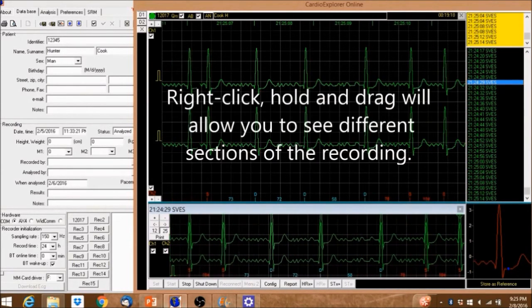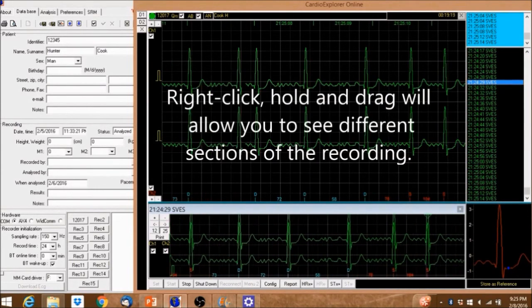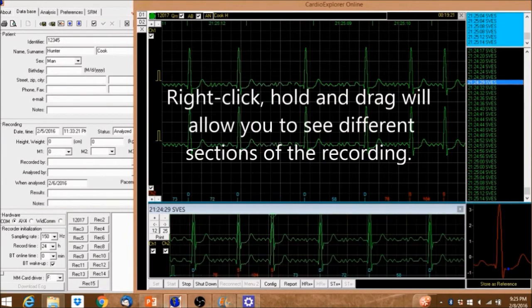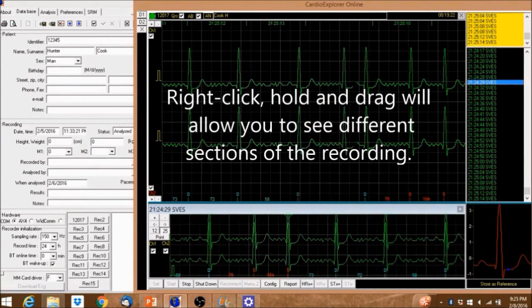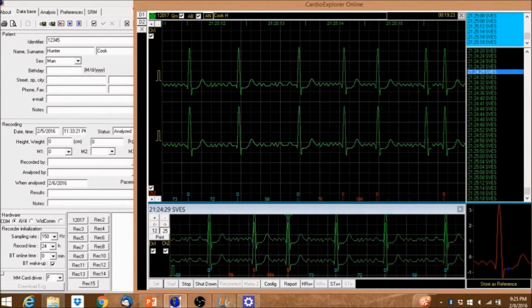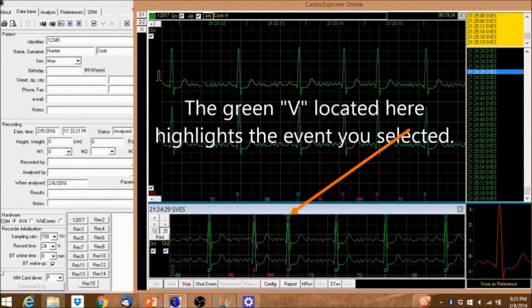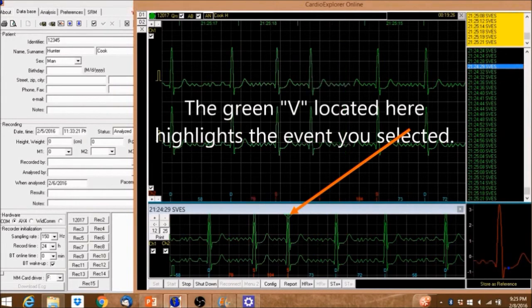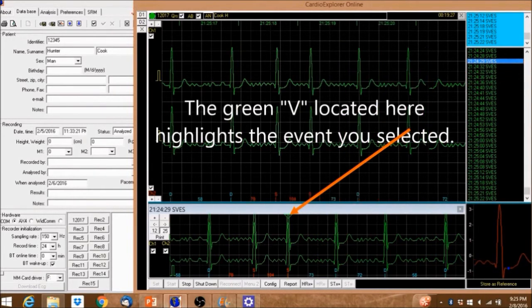Right-click, hold, and drag will allow you to see different sections of the recording. The green V located here highlights the event you selected.